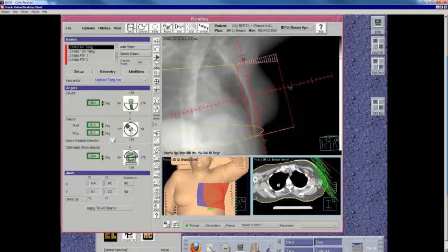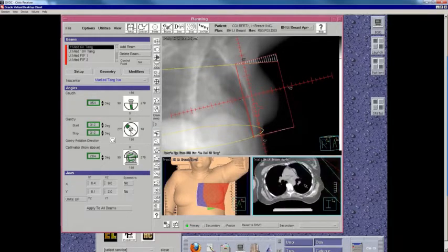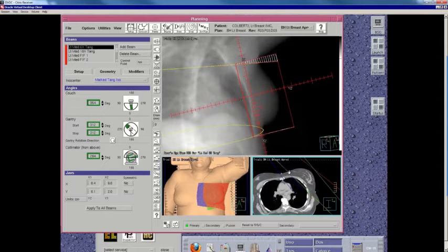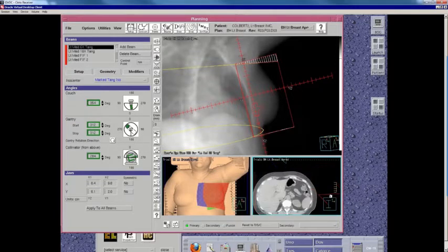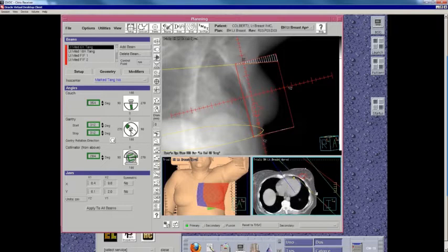So what else do we look at? Well, we try to pick a gantry angle, which is defining this ray, the deep edge. And we try to pick that to minimize the amount of lung in the field, and so that the beam itself is not traversing through the cardiac silhouette. And so this was one of those more challenging tangent cases where we were able to come up with just the right beam pairing to optimize coverage of the target volume and keep this beam off of the cardiac silhouette.